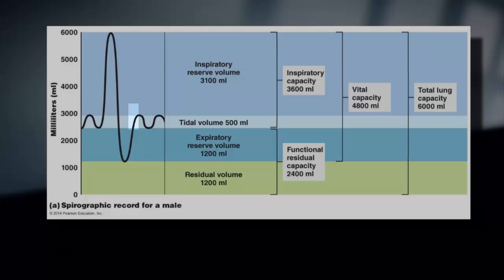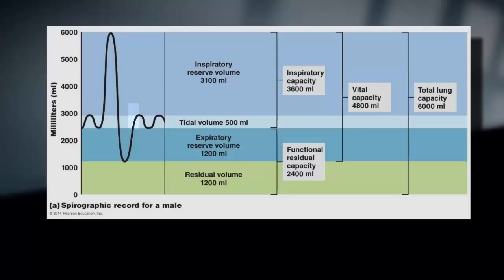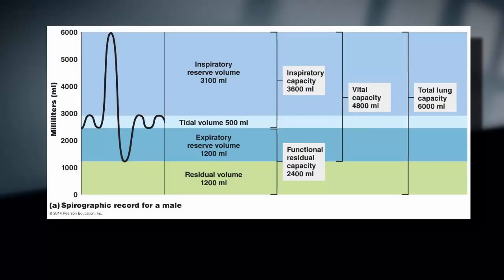Let me highlight inspiration and you will see what I mean. This will be exactly how you figure out tidal volume on your experimental spirogram. Once we ask the subject to take a deep breath in, then we can measure both inspiratory and expiratory reserve.